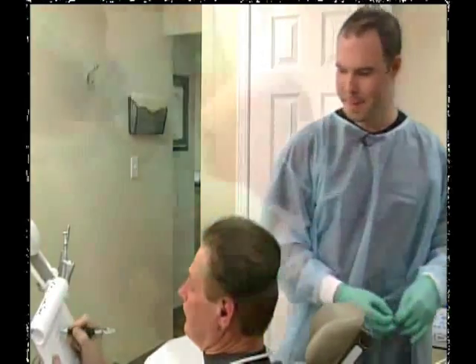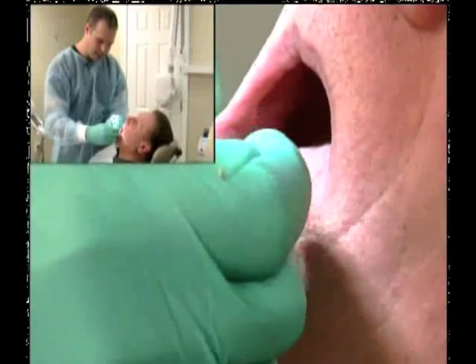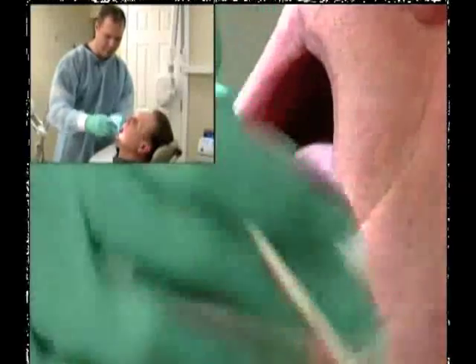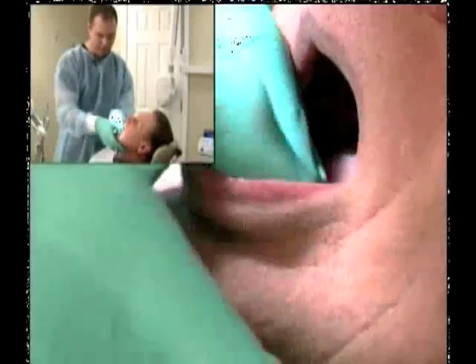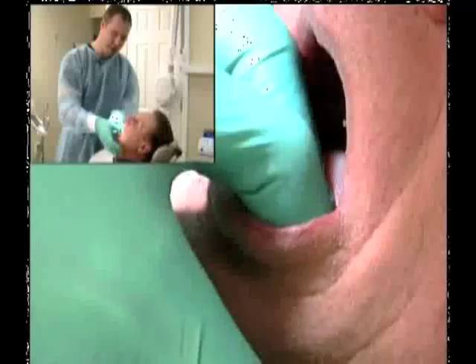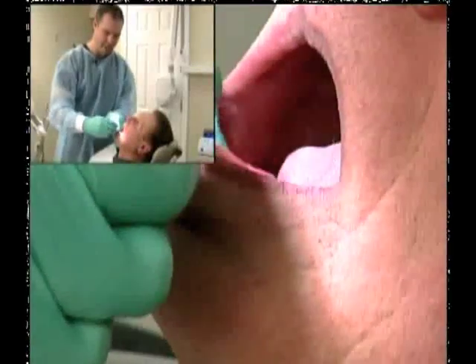So we're going to just add a little topical anesthetic on the ridge, just lingual to the ridge and just buccal to the ridge, doing a typical lower denture stabilization. Donnie just recently had all of his lower teeth extracted, all of his upper teeth extracted. He's still healing for the uppers, but we thought that he had been going through enough without having anything stable.